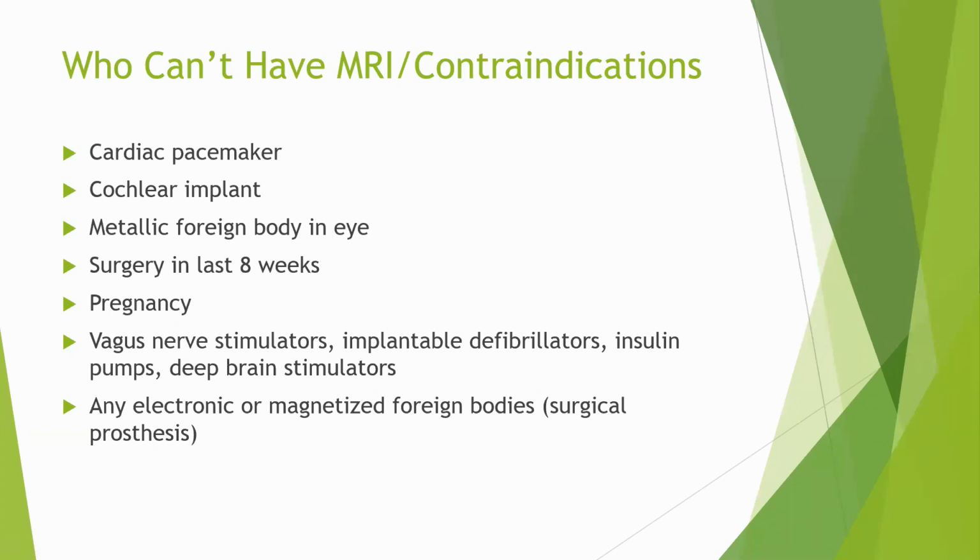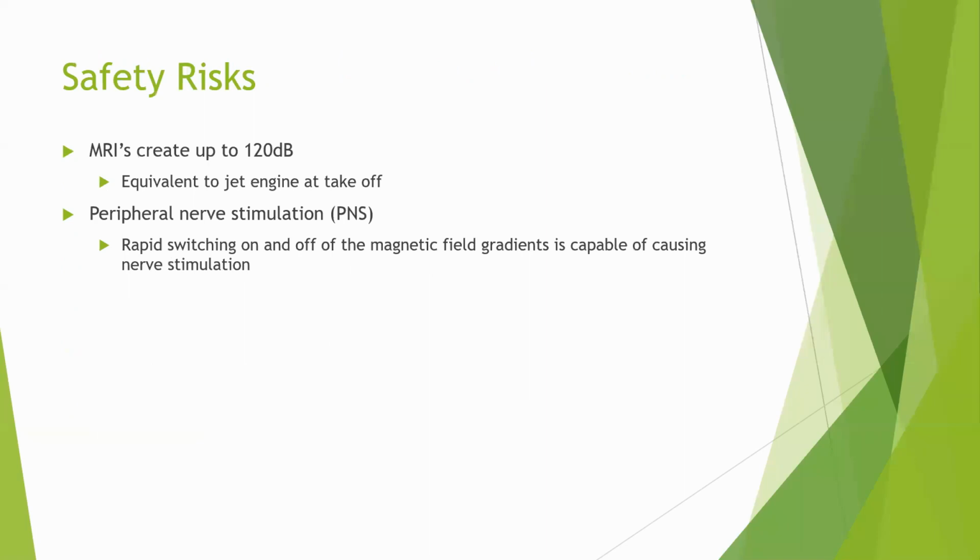All right. Safety risk. I'm not sure how many of you have actually experienced MR scans. When you are inside an MRI, it sounds really loud, because of the magnetic field and the coil generating radio frequency that rotates.